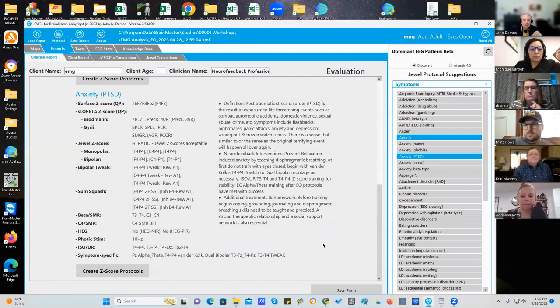That's fine. So what I've done with PTSD, you notice that one of the suggestions is C4 minus P4. So I've had experience with some clients who were over-aroused with everything. And I just did C4 minus P4, and they did fine. Did it cure them? No, but did it completely stabilize them? Yes. Just that one protocol. That's why it's there.